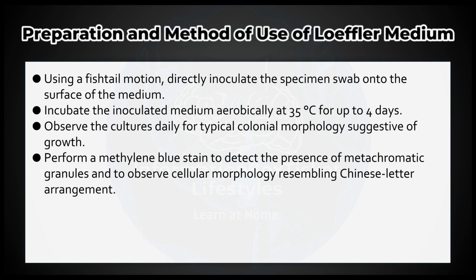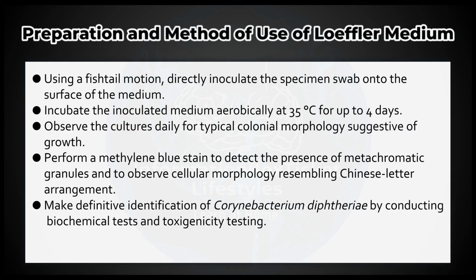Perform a methylene blue stain to detect the presence of metachromatic granules and to observe cellular morphology resembling Chinese letter arrangement. Make definitive identification of Corynebacterium diphtheriae by conducting biochemical tests and toxigenicity testing.